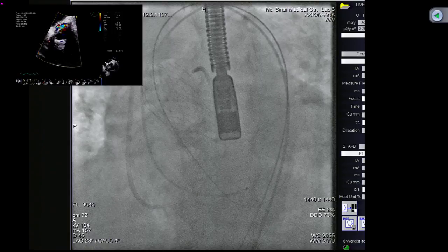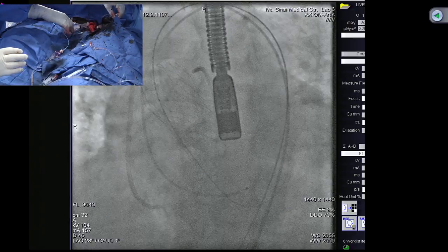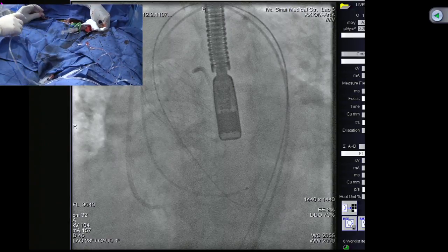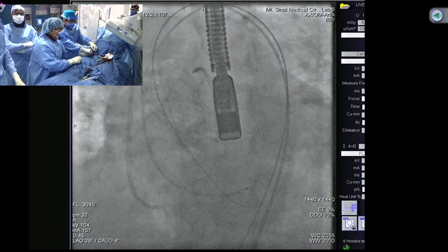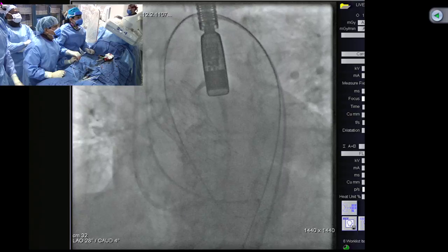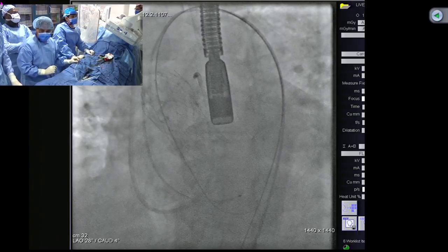Sorry, the C sheath is the troublesome sheath, but it has spurred the blood. What can you do? I kept telling them earlier, make sure everybody gets fluoro. Let's go. Yeah. There's a wide gap. There is a wide gap. Yes. Okay, they should show the echo. Good. Let's do a cine.